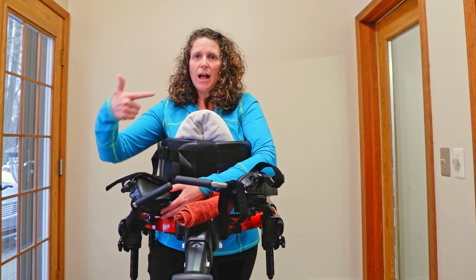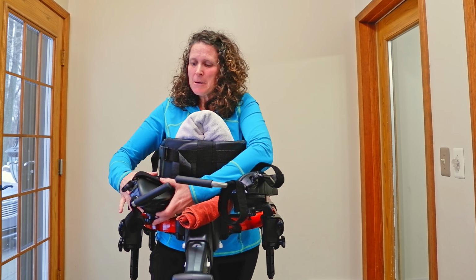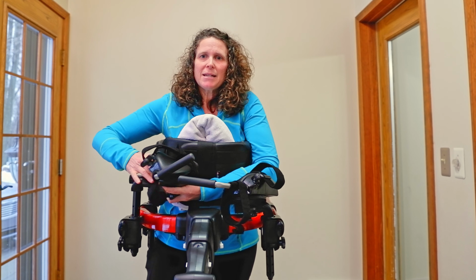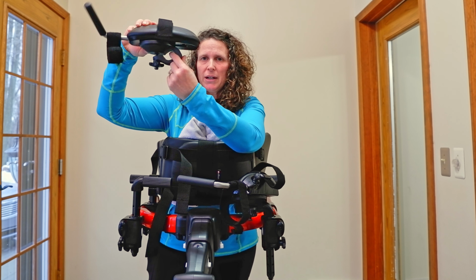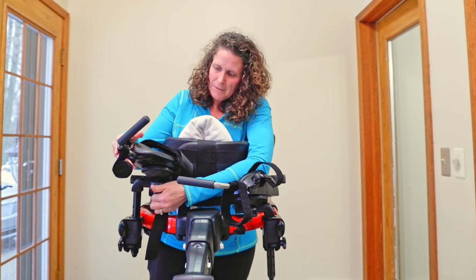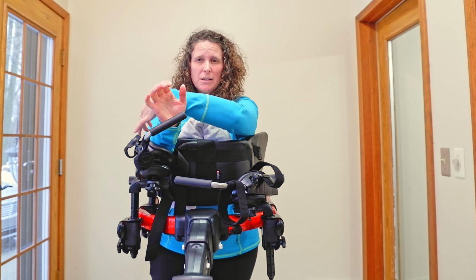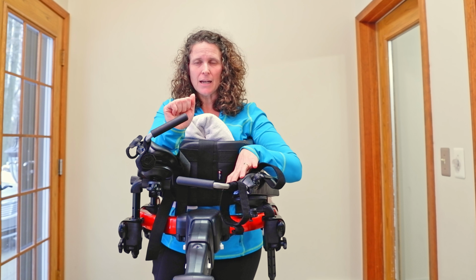One way you could do that is if your L bar is facing in or out, but it needs to be this way and not forward or backwards. You would just loosen it up on there, and you can slide it. I'm just actually gonna have to raise mine up to slide it. I'm gonna slide it out, and I'm just gonna adjust it based on this little round part here, and I can change that angle. So I pushed it forward so there was a little bit more space. Now you can see mine is adjusted up a little bit more. My angle, so that if they had low tone, their arms are tucked into a more flexed position, maybe they could push a little bit more, and you're actually giving them stability.